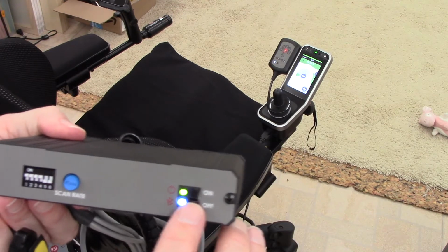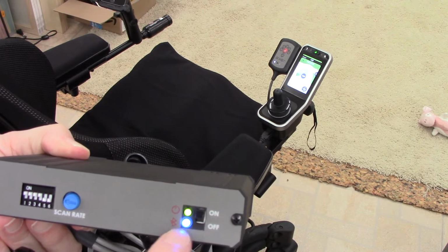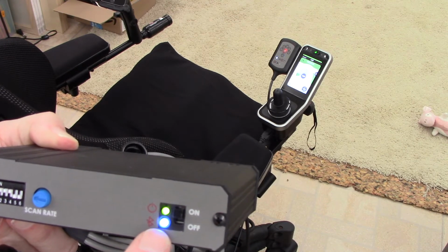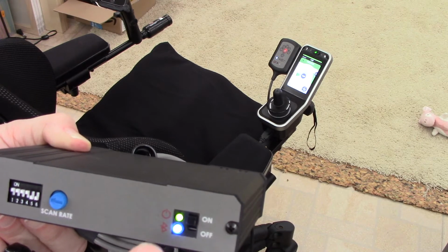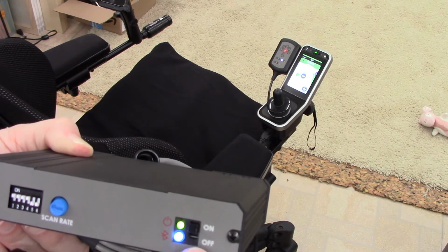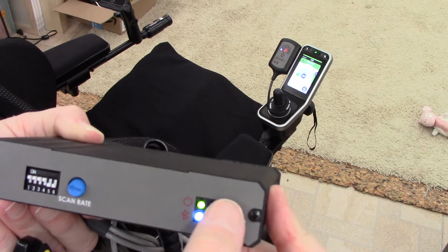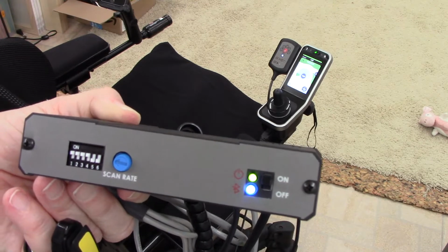We have power on, and there's that Bluetooth light that's solid. It's not flashing. It's solid because it's currently connected to a Tekla, and the Tekla is connected to a phone. So it tells you by looking at that solid light that it's paired to something. And then you can see the green light that it's on. We did that in a previous video, the green light goes off when you slide the little slider down. So that's what it looks like on the back.